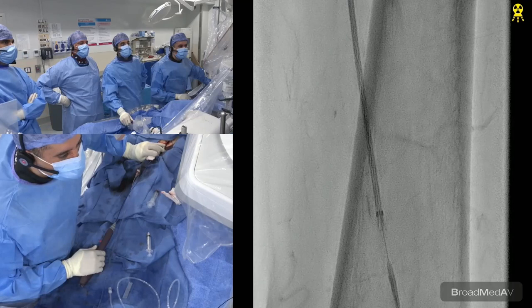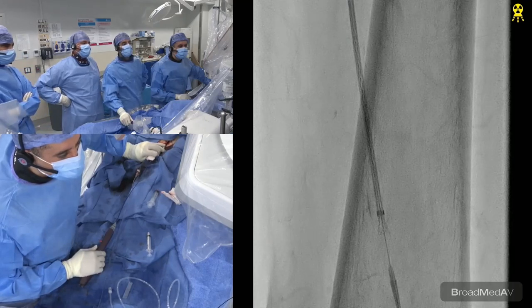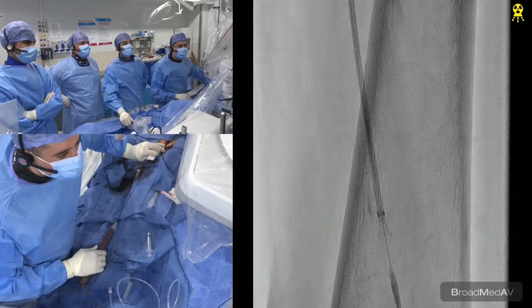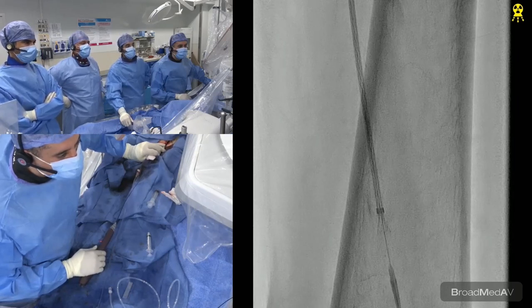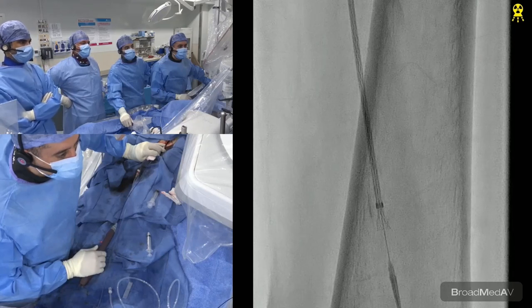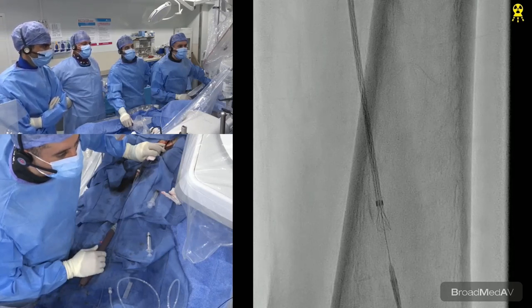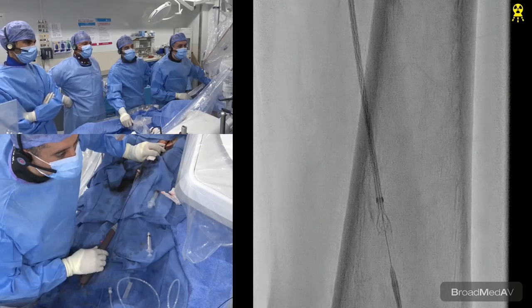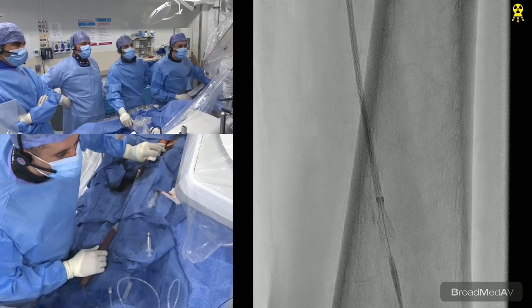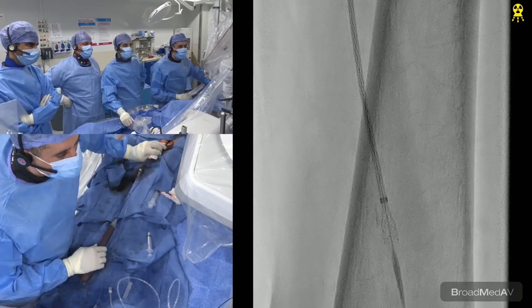You got to come back a little bit. See, right there. Now it's starting to deploy. And now it will elongate slightly right there. Perfect. So you'll see as it comes out, once it catches, it's going to become butter. So right now he's got to let it come back a little bit. Now come forward, let it come out slowly. Very slow throws, guys. Very slow. This next throw is going to allow it to catch it.